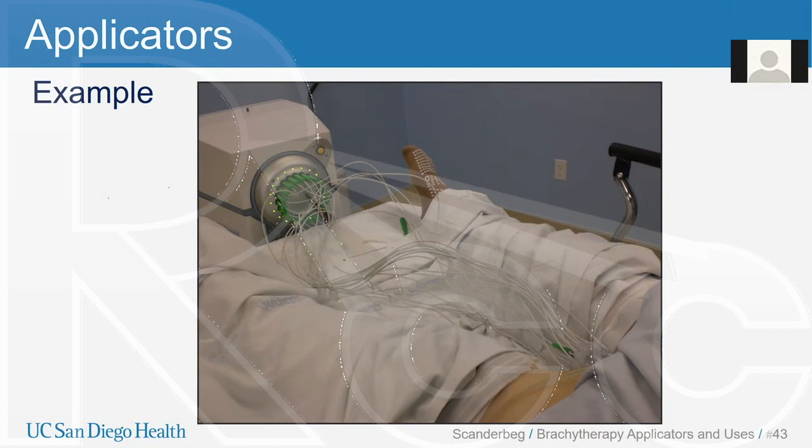So it's definitely a place to look at implementing safety barriers to ensure your proper connections. This is just one example of what to look for when starting a program. There should be some thought experiments on what's likely to occur, even what's unlikely to occur but still a possibility, and how those events can be mitigated if they could potentially lead to patient harm.